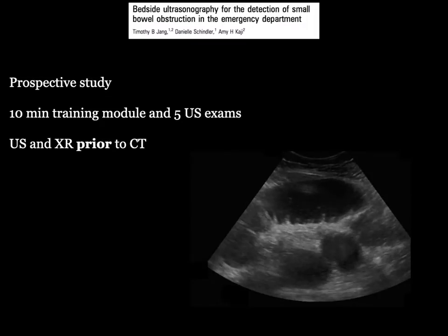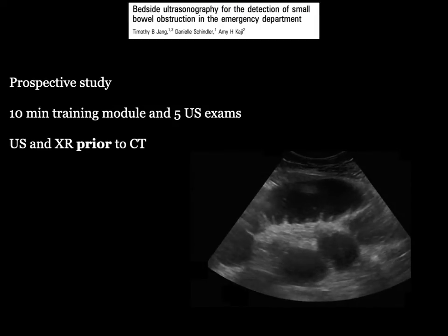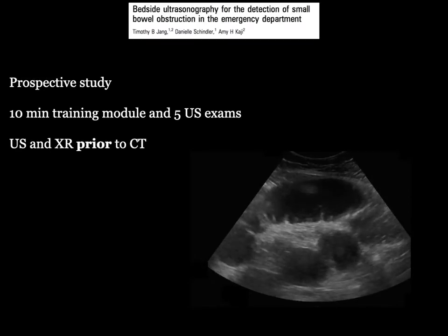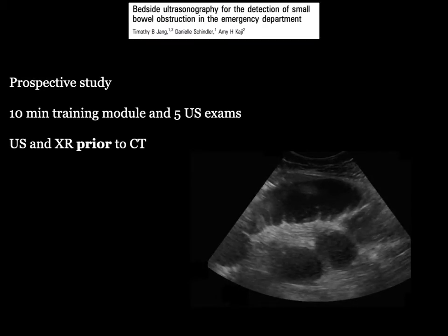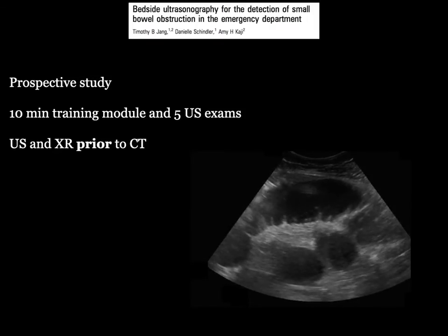So looking at some of the American literature in particular in emergency medicine, this is a very nice study that was published in Emergency Medicine Journal in 2011, looking at bedside ultrasound to detect an SBO in emergency department patients. This was a prospective study.